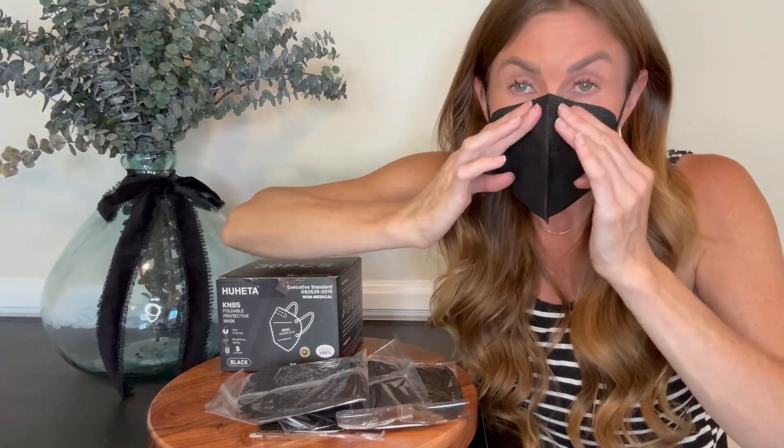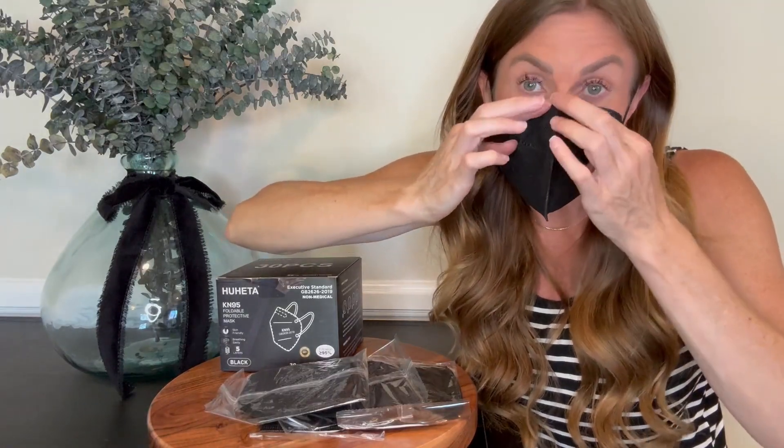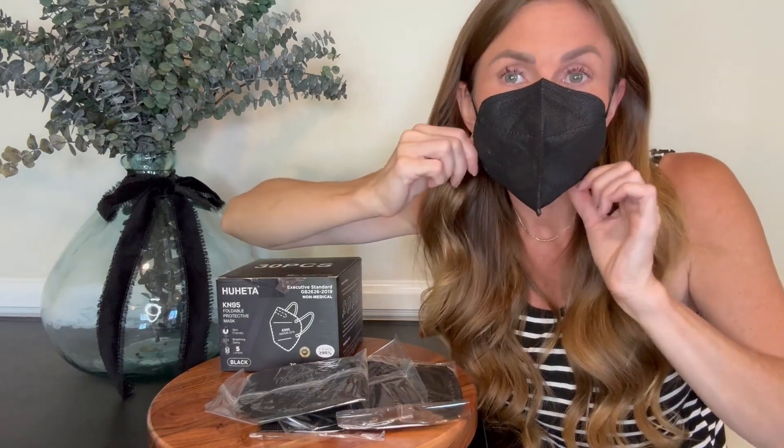So as you see, I put it on and then I adjust the metal bendable nose piece there, and I can customize the fit so that it feels real nice and comfortable. The elastic straps are strong and they're not going to pop off or anything like that.